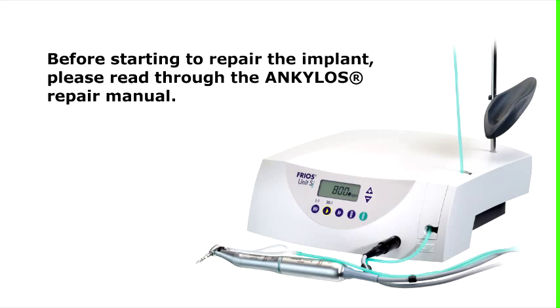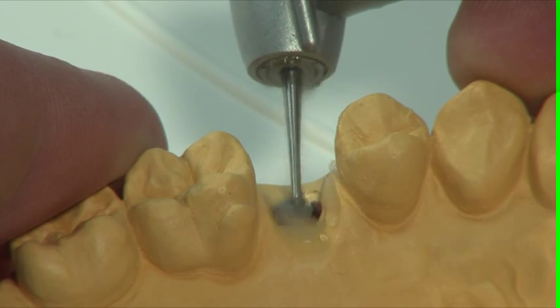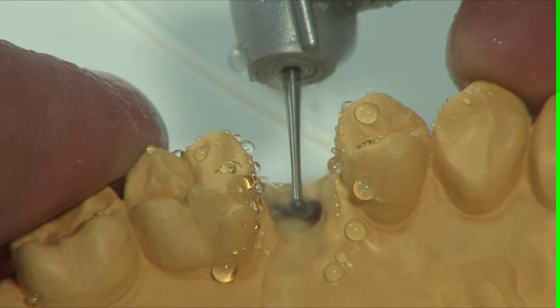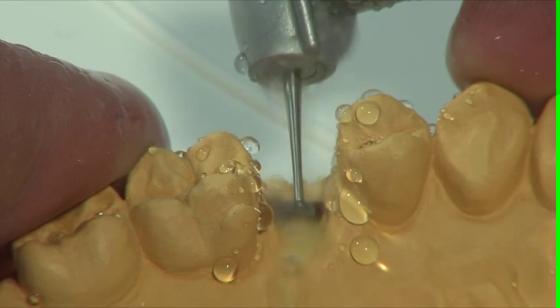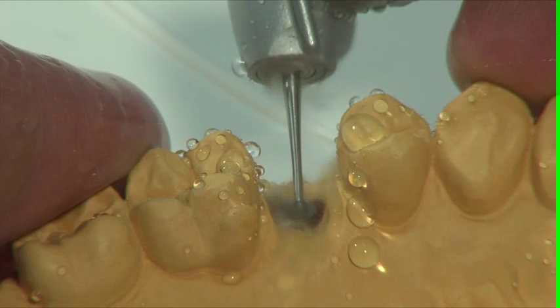Before starting to repair the implant, please read through the Akylos repair manual. Take a standard round drill or diamond with the diameter 1.2 mm to 1.4 mm and punch mark the center of the abutment.